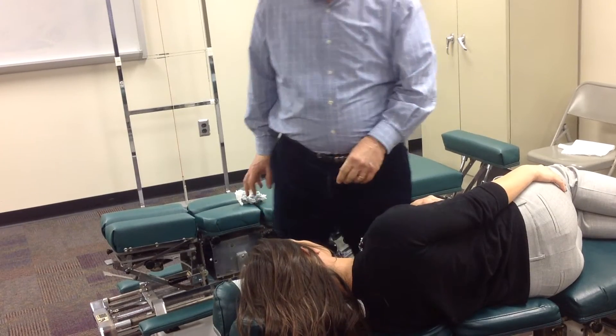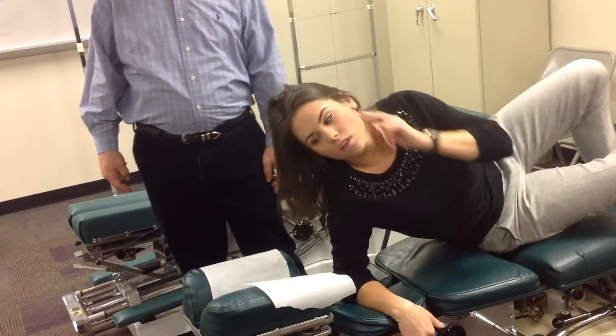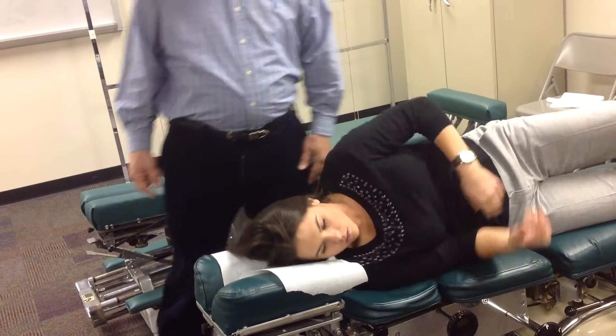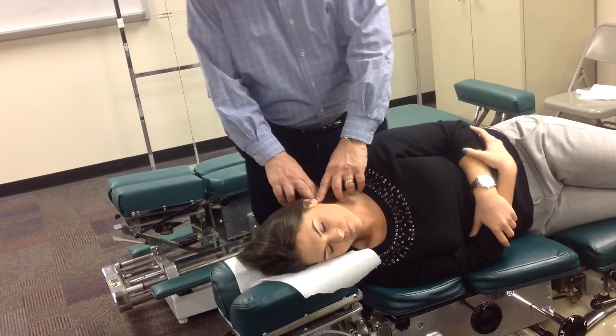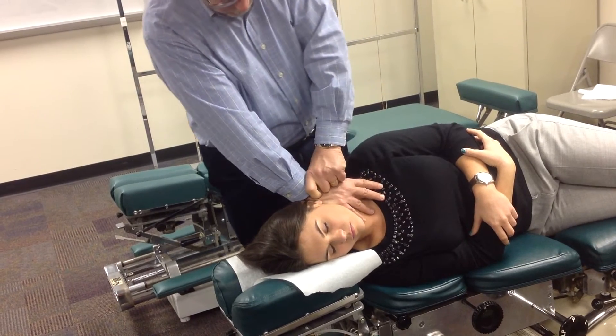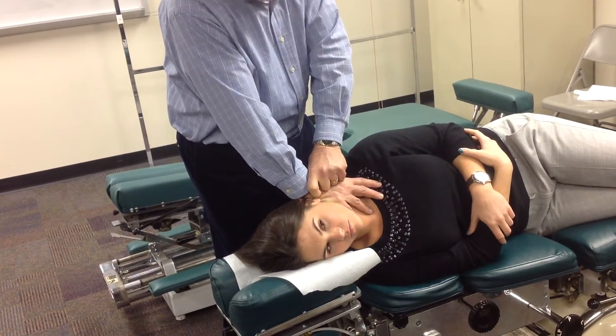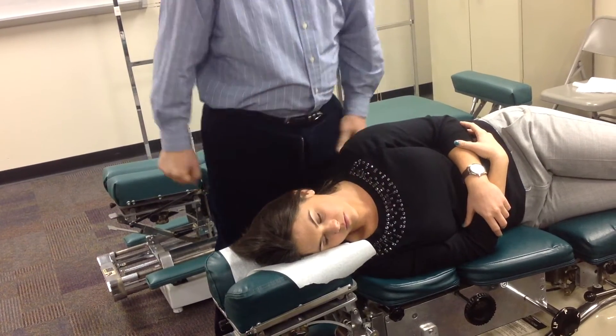If doing it from behind, for a right cervical syndrome with no tender nodule, I'd tilt the headpiece down, do a tissue pull, make my contacts, stand slightly superior, and perform a regular toggle thrust.